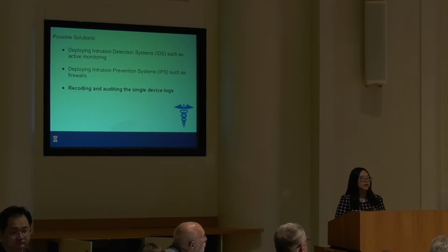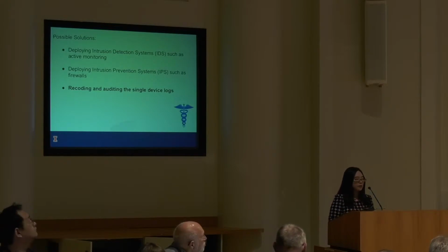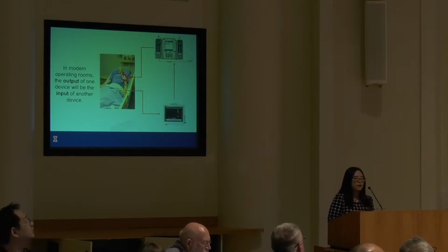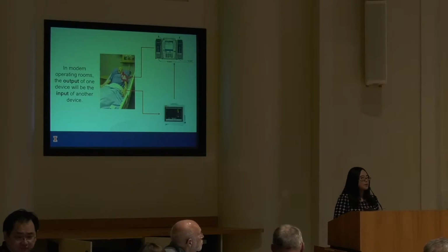So in this project, we propose recording and auditing device logs to identify causes of attacks and help forensic investigations. However, recording and auditing single device logs is not enough. In modern operating rooms, the output of one device will be the input of another device. For example, in this case, the output of the monitoring device would determine how much insulin should be injected into the patient, and this acts as the input of the insulin pump.